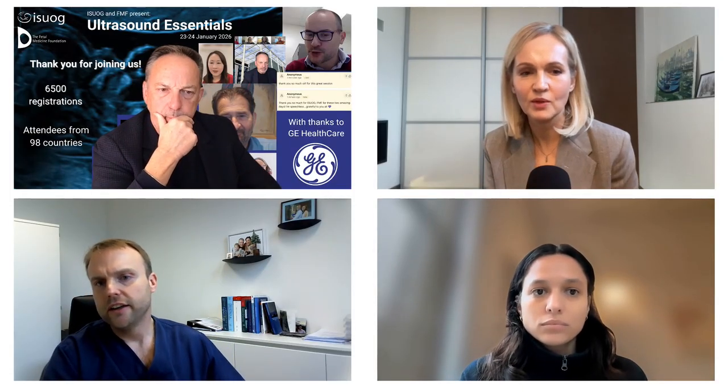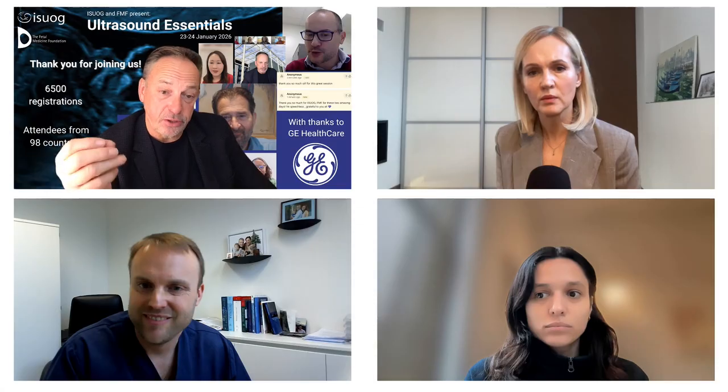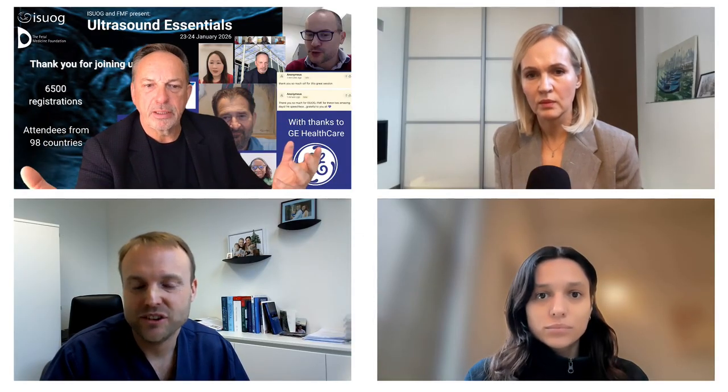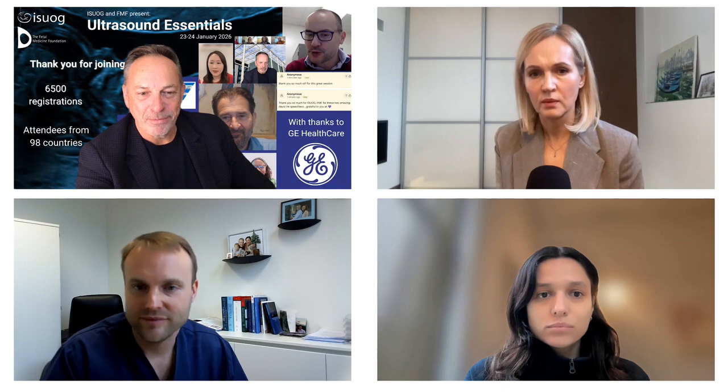I think it is an option, because sometimes, depending on the constitution of the patient, or if she had surgery and the ovary is in an abnormal position, MRI can help you to identify the origin of the lesion. If it will help you to say whether it's benign or malignant, that's another question. MRI also often struggles in cases where ultrasound struggles. But the obvious thing is if you can see the normal ovary separate, that helps you, right? It's not about the nature of the mass, so to speak, but that's your first discriminator. Can I see a normal ovary separately? Because that's basically the first thing.